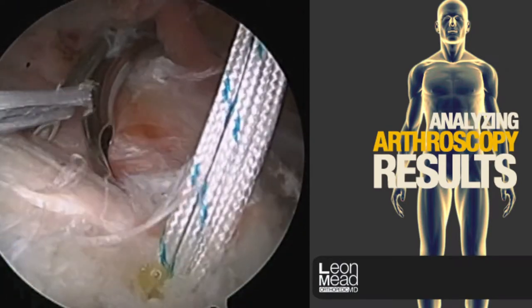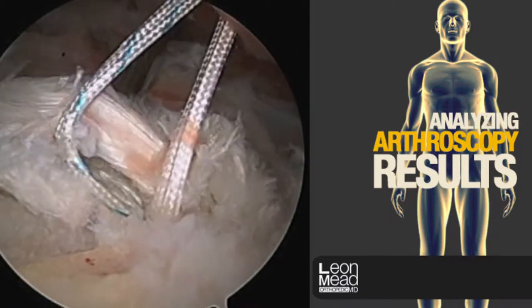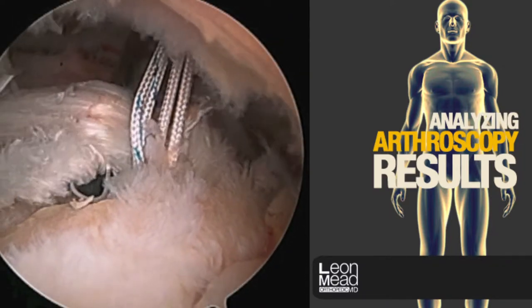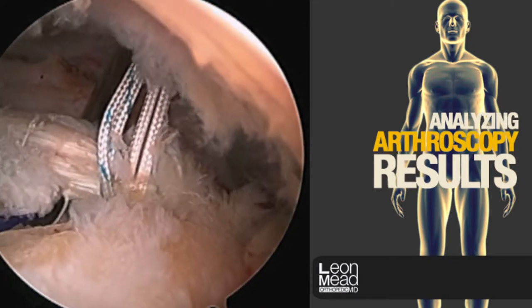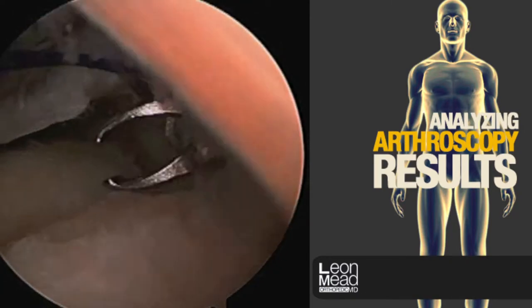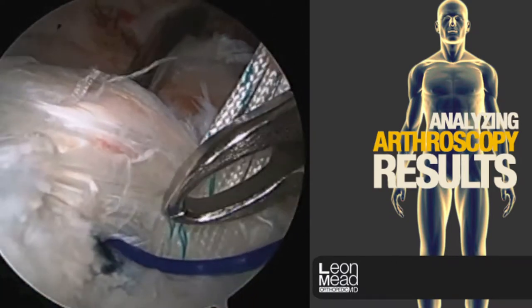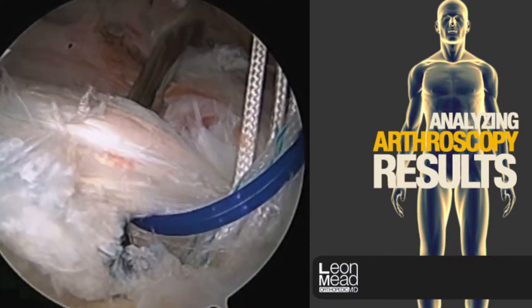The biceps tendon in this individual is markedly abnormal and will contribute to postoperative pain unless it's dealt with appropriately. We're going to perform a tenodesis, which essentially transplants the attachment of the biceps tendon outside of the joint, adjacent to the rotator cuff. This tissue normally glides back and forth and, being so abnormal, can be a source of pain. We're using a suture passer to pass a suture through the biceps tendon itself.